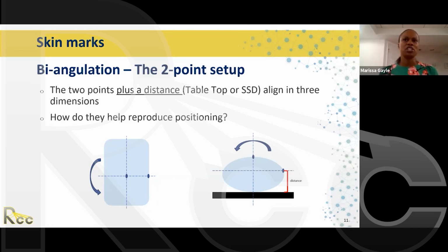Like I said, many of our patients that have their arms down are usually down for two reasons. They legitimately can't put their arms up, and we try not to do sims with the arms down. Sometimes it was something simple, like an APPA plan or a 3D plan that did not have lateral beams.